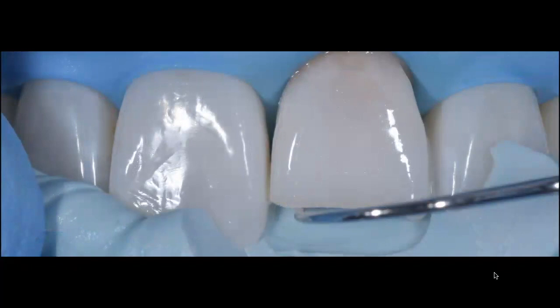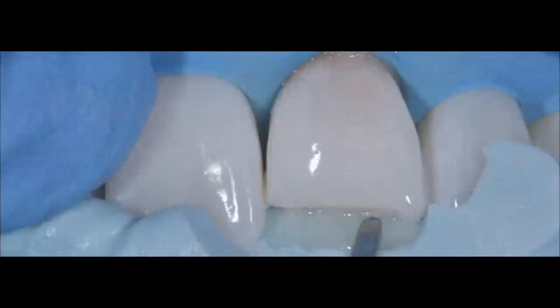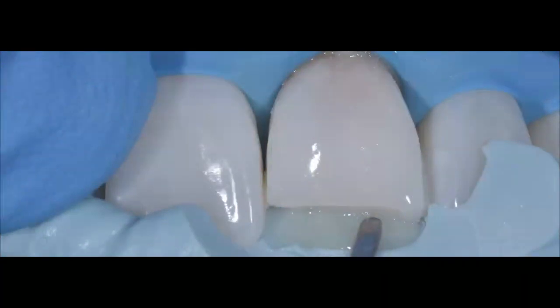The reason why I do this is that when I apply my composite onto the matrix and then into the mouth, I want to make sure that that first lingual layer actually contacts at least half of a millimeter of a little bevel that I created on the lingual aspect, so that I know that the resin is actually in contact with tooth structure, with enamel on the lingual surface. So here you can see I've applied that first layer of enamel, and now I am just condensing that enamel with a very small spatula, making sure that there are no bubbles, that the enamel and the composite are coming together. And this is again the BL trans, that's the enamel that I chose to use for this case.